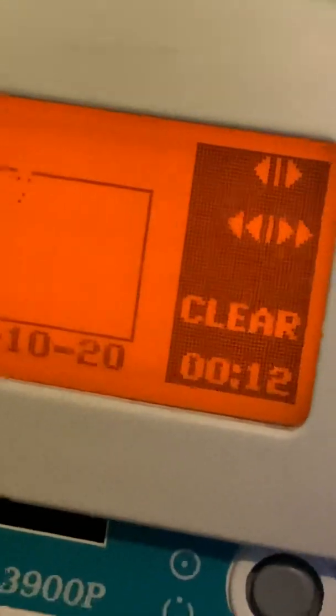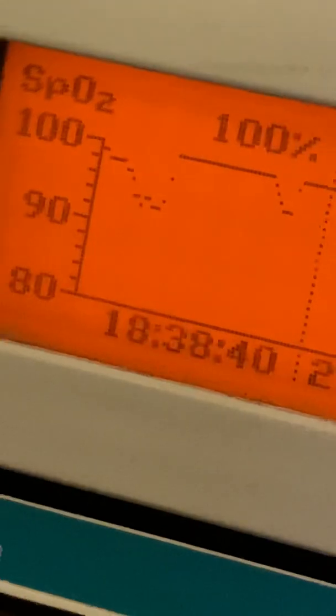You can look at the patient's oxygen saturation history. I have trouble with my vision so I have to get up real close, but if you look at this you'll notice that it scrolls back in time.